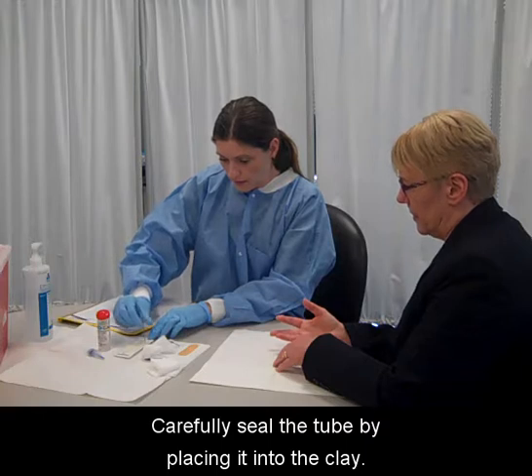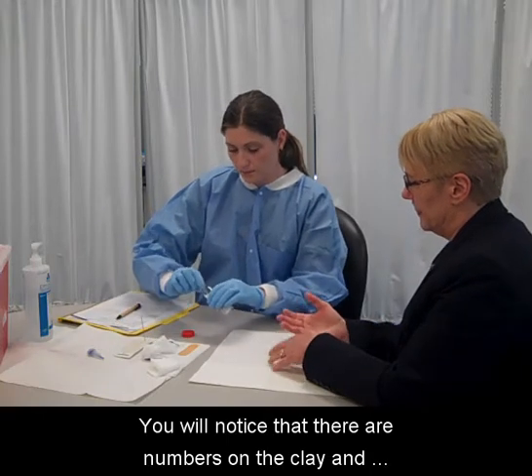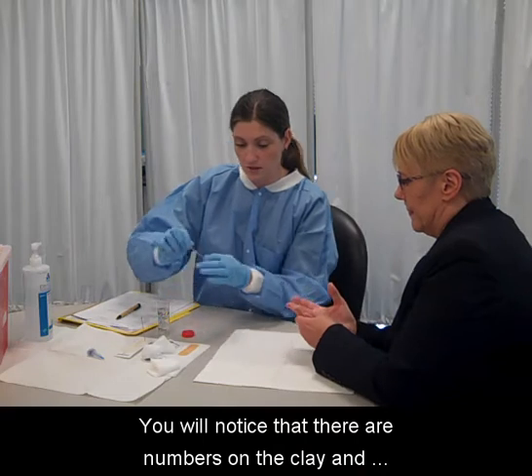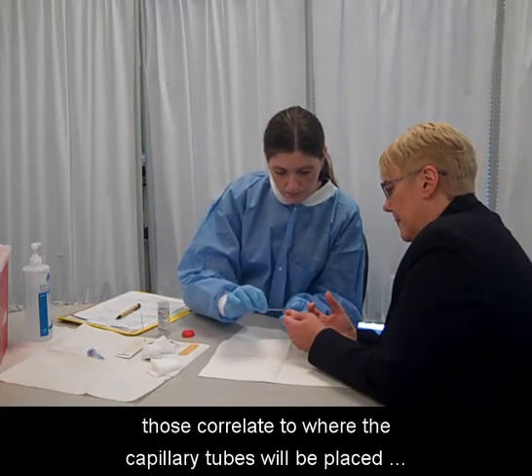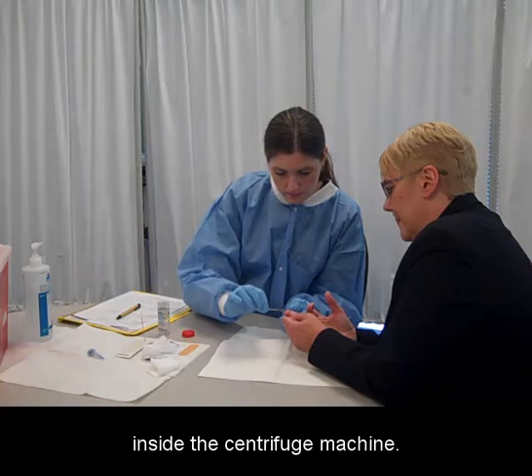Carefully seal the tube by placing it into the clay. You will notice that there are numbers on the clay, and those correlate to where the capillary tubes will be placed inside the centrifuge machine.